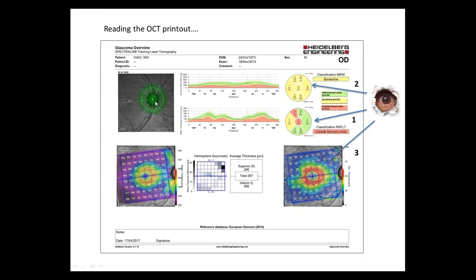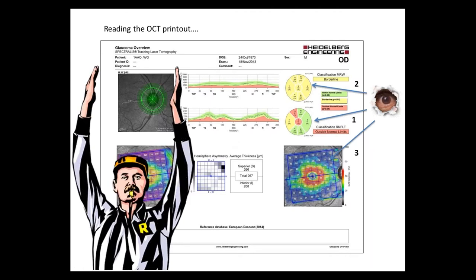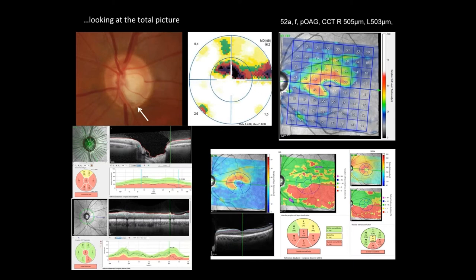The infrared picture gives an idea of disc cupping — we see in the upper and inferior parts a pronounced thinning of the neural rim and enlargement of cupping. The ganglion cells serve as a referee when minimum rim width and nerve fiber layer don't point in the same direction. Finally, we look at asymmetry not only between right and left eye but also between upper and lower hemifields. Here we look at the typical picture of a glaucoma patient with all the measures needed to judge and grade the patient.